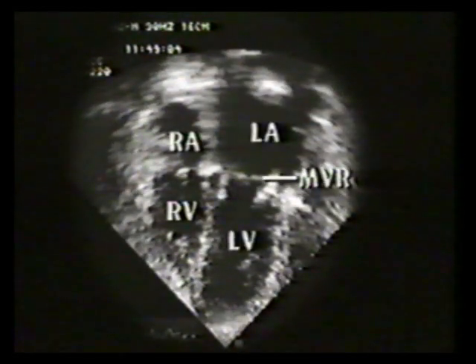This study is from a 56-year-old female with a Carpentier-Edwards heterograft mitral prosthesis. The stents are usually oriented toward the septum. As with mechanical prostheses, the echocardiographer should answer several routine questions during evaluation of a bioprosthesis.